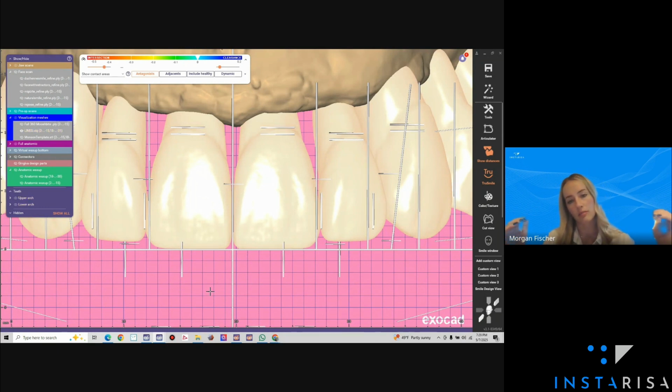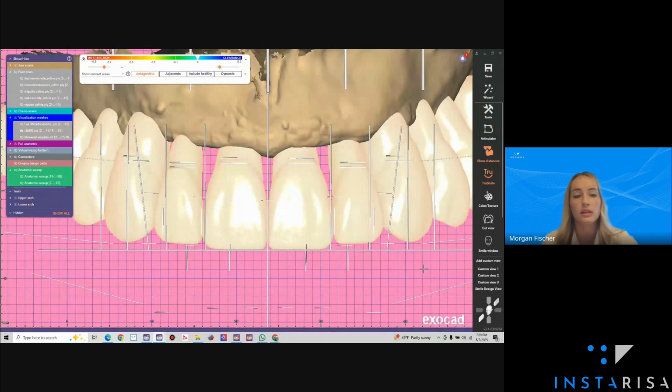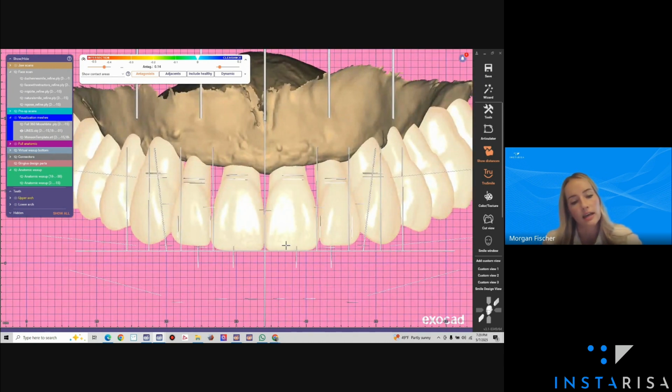We like our laterals to be about 1 millimeter higher than 8 and 9, and then we want the canines to be 1 millimeter higher or equal to 8 and 9. In this instance, I had to make them 1 millimeter higher because the lower is crown and bridge, and I was kind of struggling for space there. And then we're just looking at the next step, gingival curve.